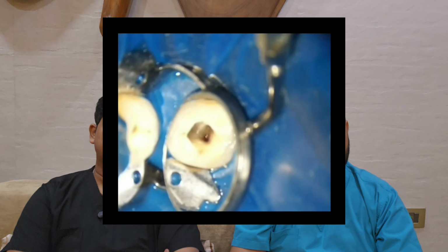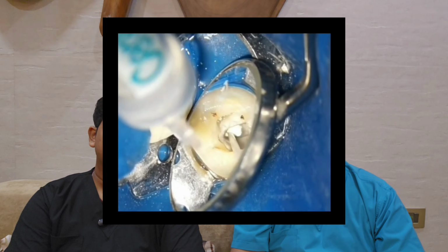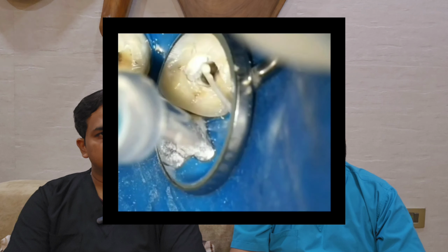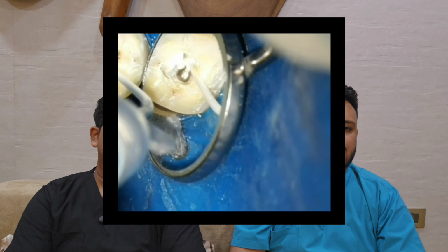The only thing you have to know is how much pressure you have to apply while injecting this material. Basically, you have to know what materials you're working with, what is the density of the material, how much pressure has to be exerted, until what level it has to be filled, and what material has to be used. Like, I feel this is a wrong material choice which has been used.